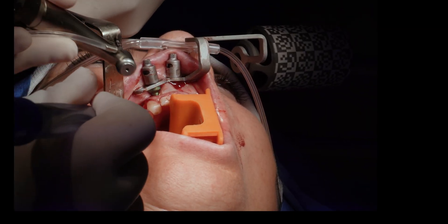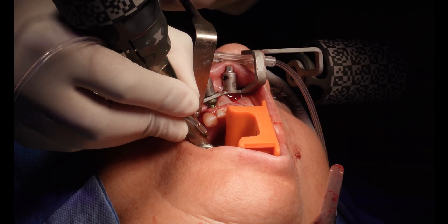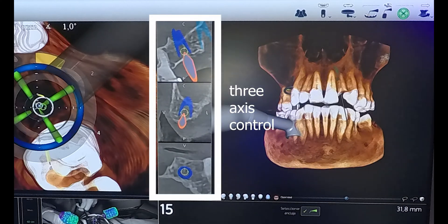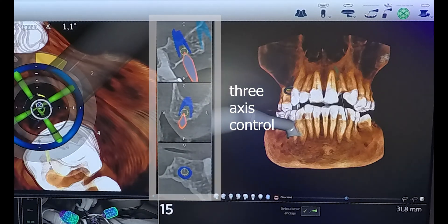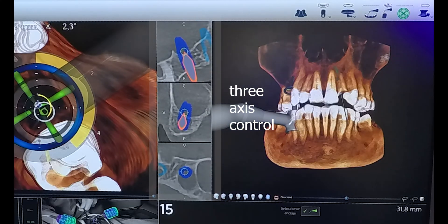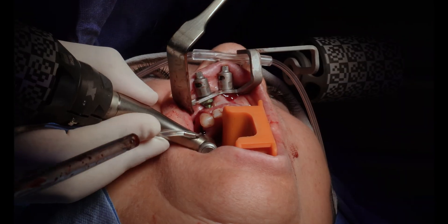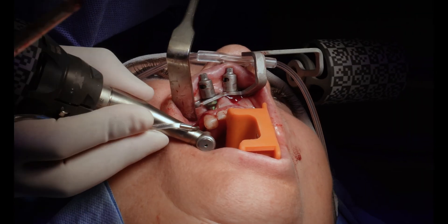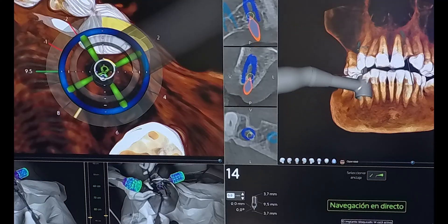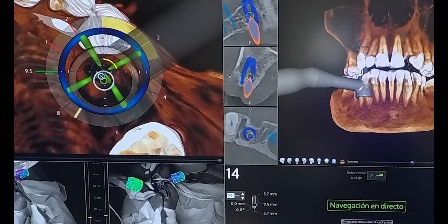It's interesting to notice that the position of the surgeon changes significantly during this type of navigated surgery. I sit myself over the head of the patient with my head looking forward so I can see the screen. Once I know where I am in the oral cavity, I look at the screen and follow the yellow line that tells how deep I'm going, and I can see the X, Y, and Z markers in the position of the implant — controlling the direction of the bur, like a target. I feel a good correlation once the cortex has been perforated, and the image on the screen eases out as you go in, giving a sensation of security.